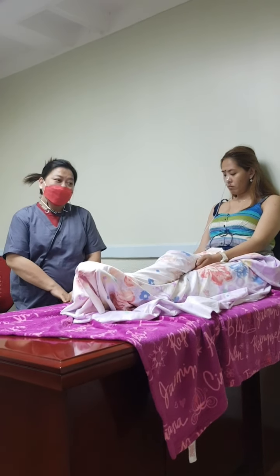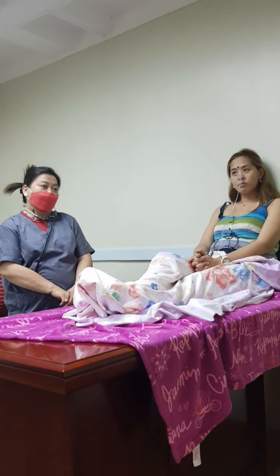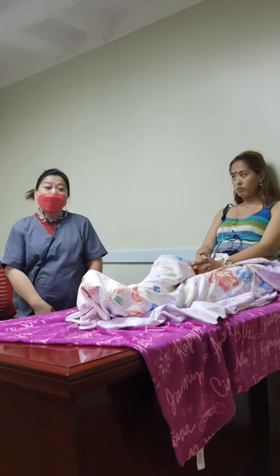That's the return demonstration that I did for nasogastric tube. Thank you.